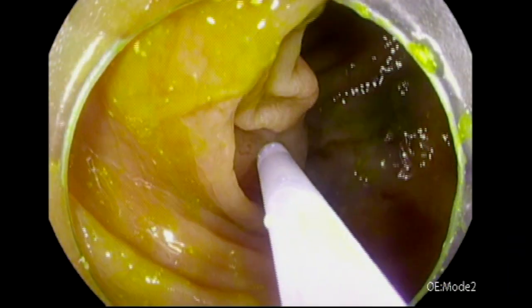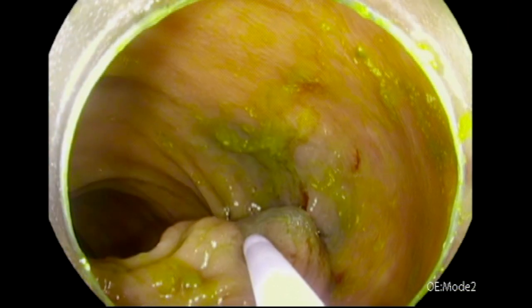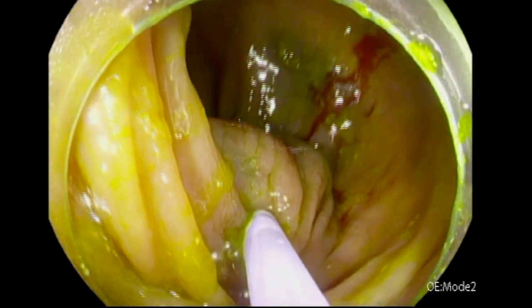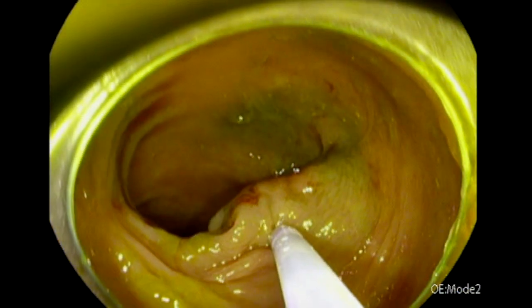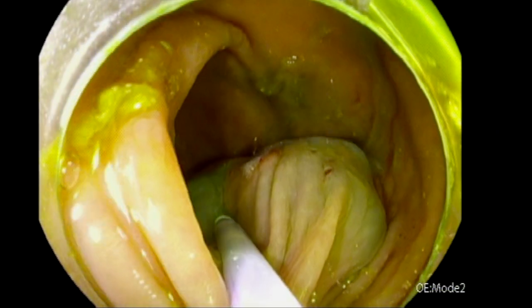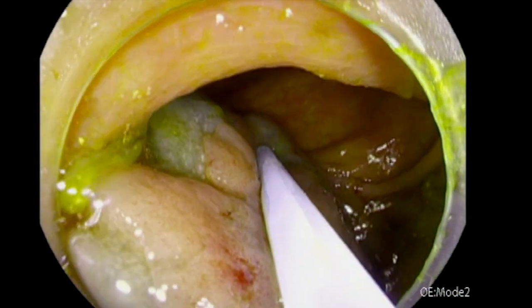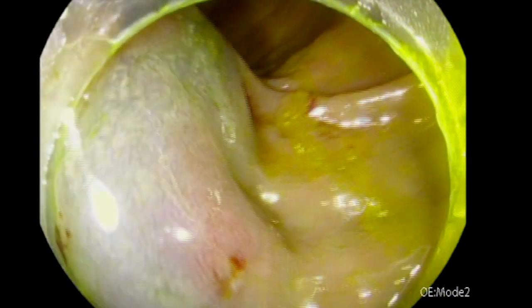So instead of injecting the lesion in pieces or small areas and then dissecting, we'll try to inject the whole lesion. As you can see, I'm trying to do dynamic injection in this lateral spreading granular lesion, but it's not easy because the lesion was tattooed before. You can see the tattoo there. We are doing the submucosal injection, ensuring we're injecting behind and in front of the lesion on all sides, obtaining a very nice submucosal lift, and making sure to embrace behind the lesion into the normal tissue.